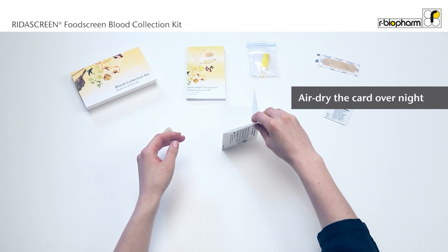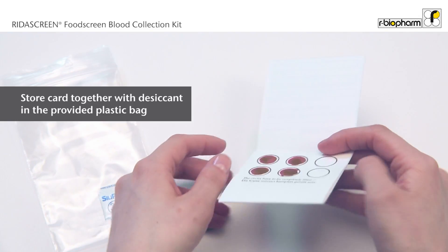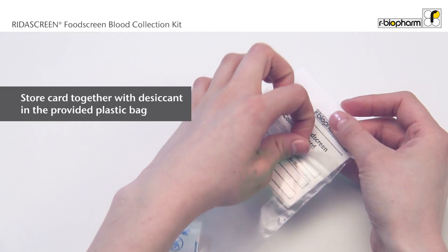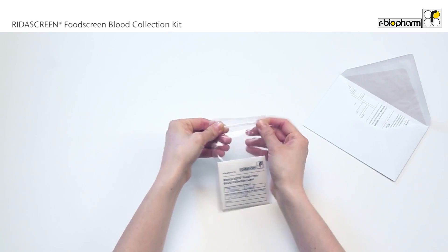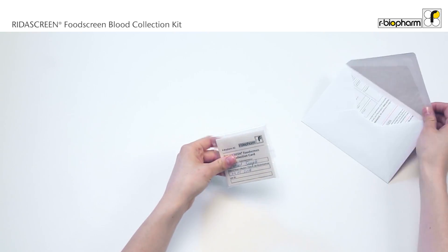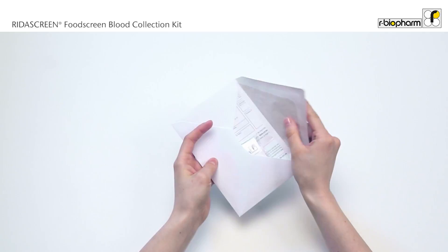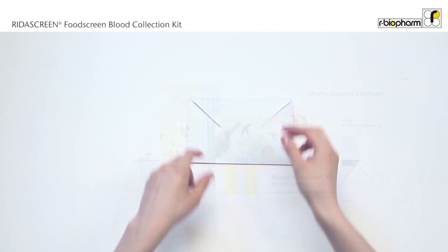Once the card is completely dry, fold it and place it in the plastic bag with the desiccant. Fill out the provided forms from the laboratory. Put the plastic bag with the blood collection card and, if applicable, the completed laboratory forms in the envelope. Seal it and mail it to the laboratory.